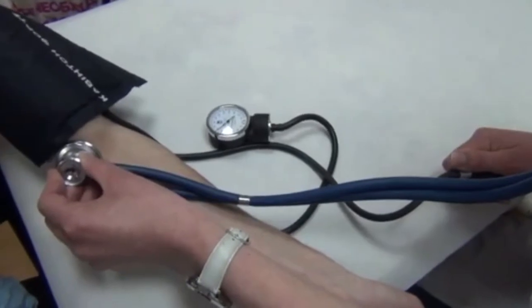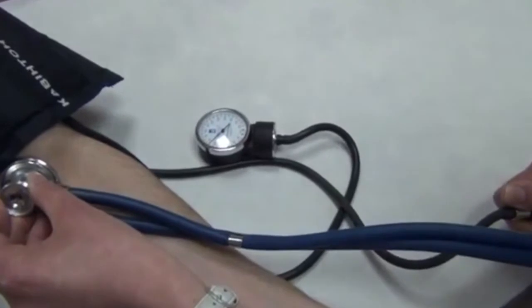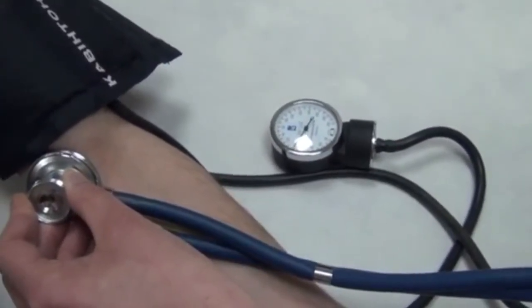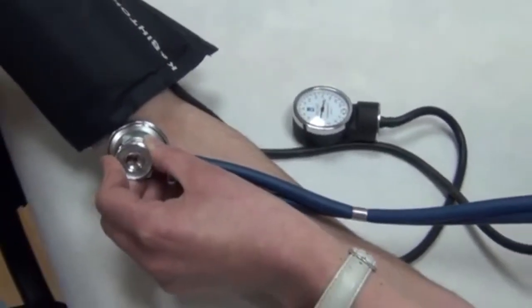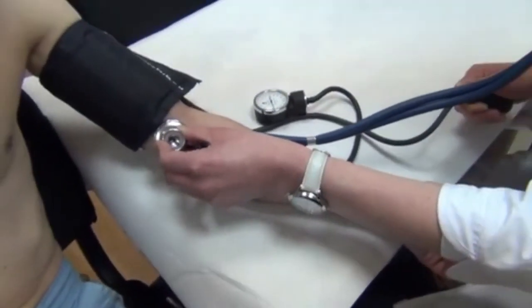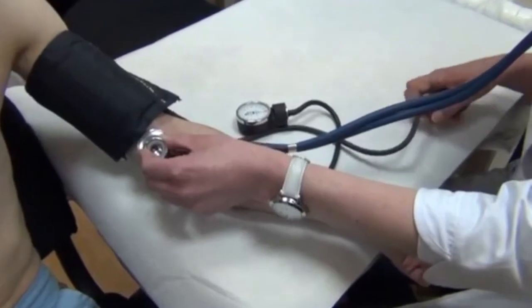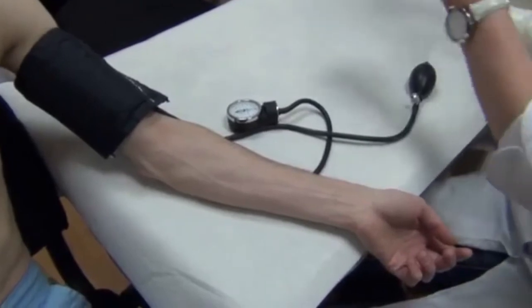After that, we deflate the air from the cuff at a speed of approximately 2 mmHg per second. We estimate the auscultation signs that appear over the brachial artery. The appearance of the first Korotkoff tone over the brachial artery corresponds to the systolic blood pressure. The diastolic blood pressure is recorded when the sounds over the brachial artery disappear, reflecting the fifth phase of the Korotkoff tone.